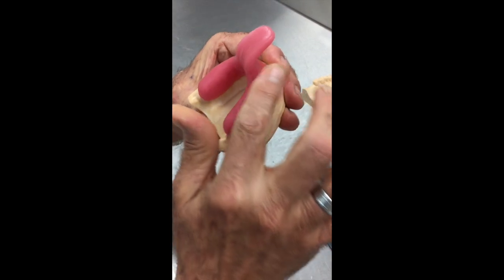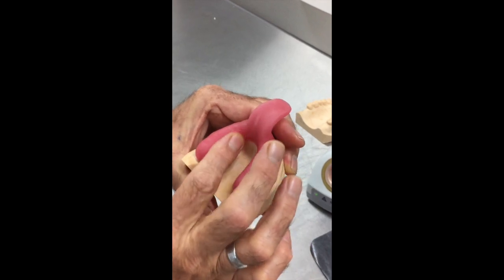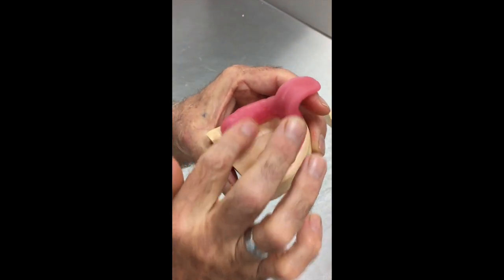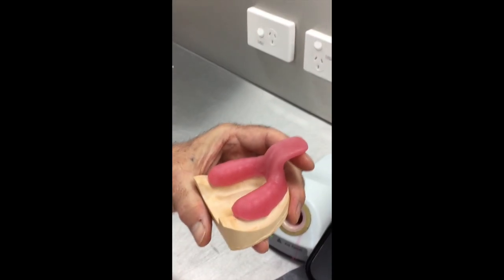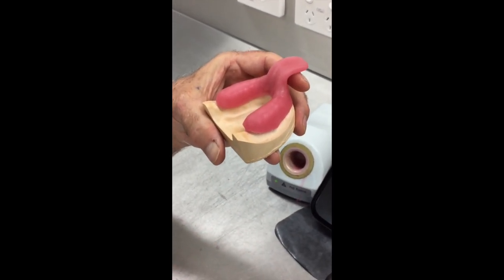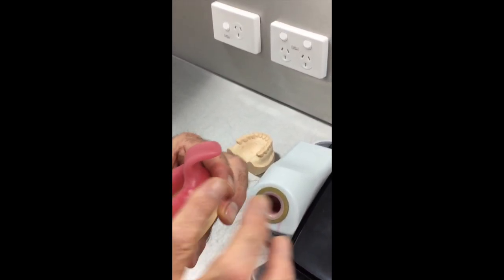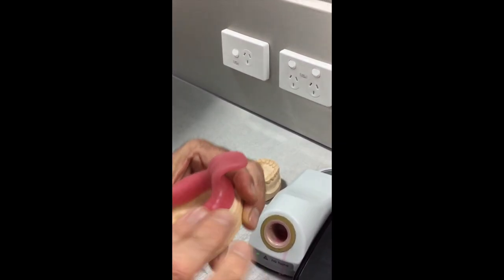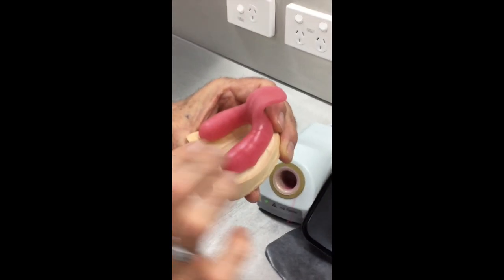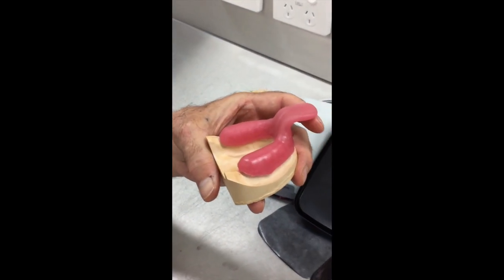We can do a lot more here in smoothing this up. It depends on your requirements in surgery. Just blending this in, and now it's ready for us to go into the light curing unit. If you want to get a better finish, you might use a small amount of Vaseline and then smooth it like so, and that will give you a slight sheen, and when it's cured we will end up with quite a smooth area. Okay, so now we're ready to go to the light curing unit and cure this tray.